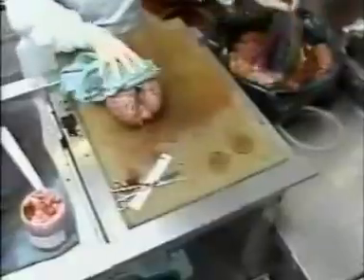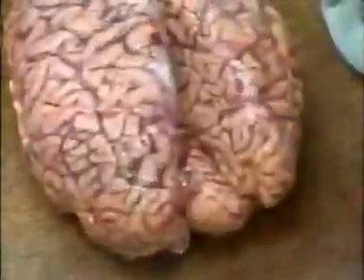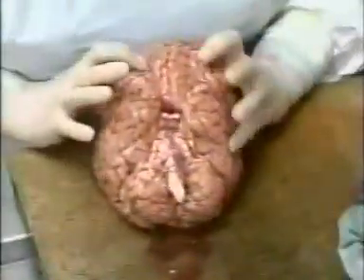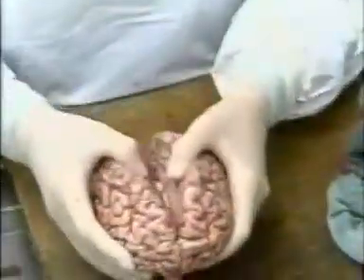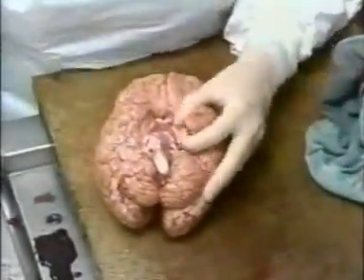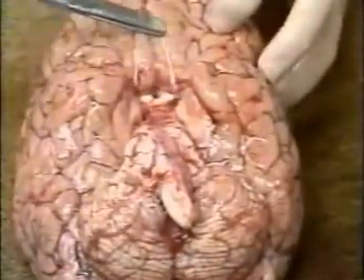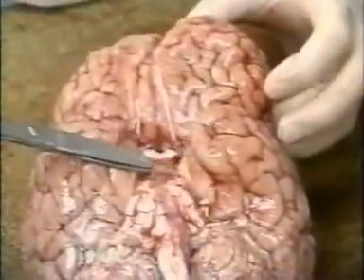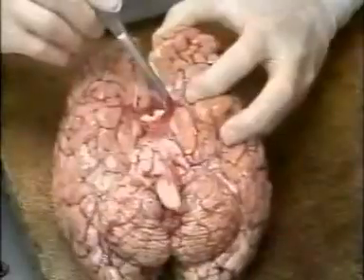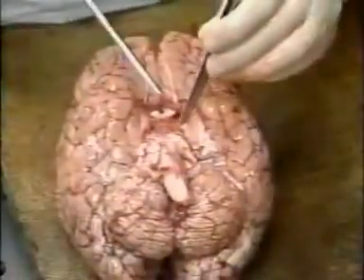Finally, the brain. Nice symmetry, no evidence of some process involving one side of the brain over the other. The inferior surface, and now it shows the various cranial nerves. The olfactory nerves are the two long ones across the front of the brain. That's what she's touching now, where the optic chiasm is, where the optic nerves cross. Various cranial nerves extend off to either side of the brainstem. That's like the trigeminal. This is the internal carotid. The vessels are intact, do not have atherosclerosis.